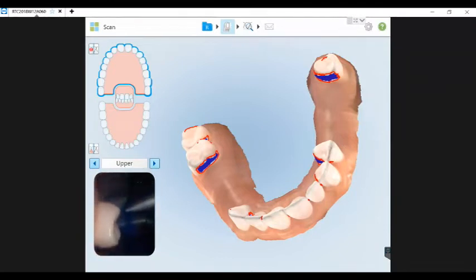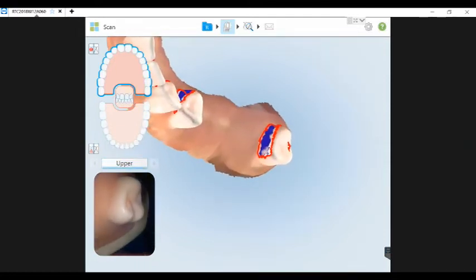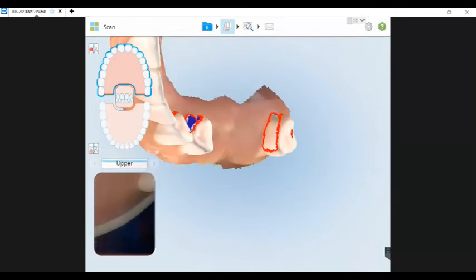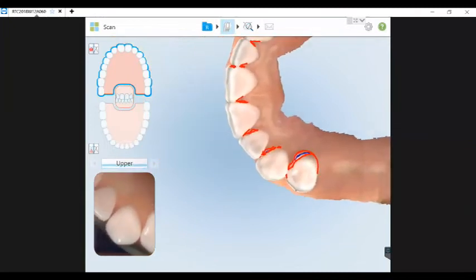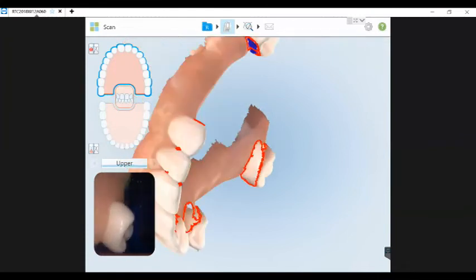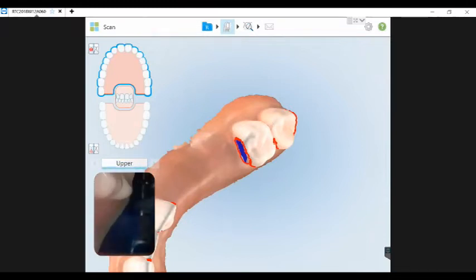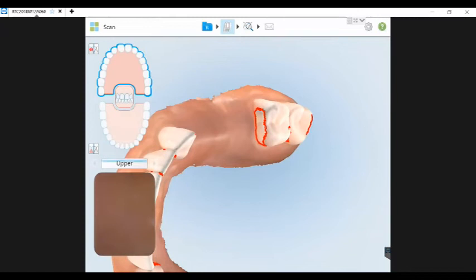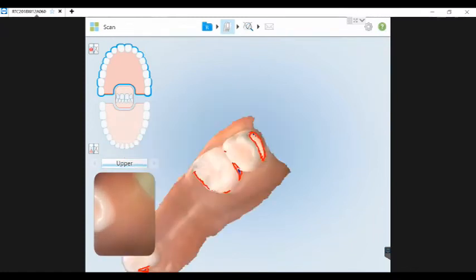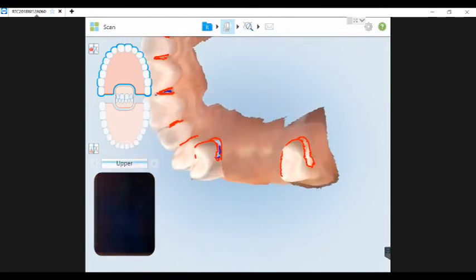And we need to go back and capture that relatively quickly. And it will turn tooth colored as it begins to fill. You can leave that on and go to different areas to capture that as you're going along. There. That one. And oftentimes it's the distal of those second molars as well. Great. I hope that was helpful.